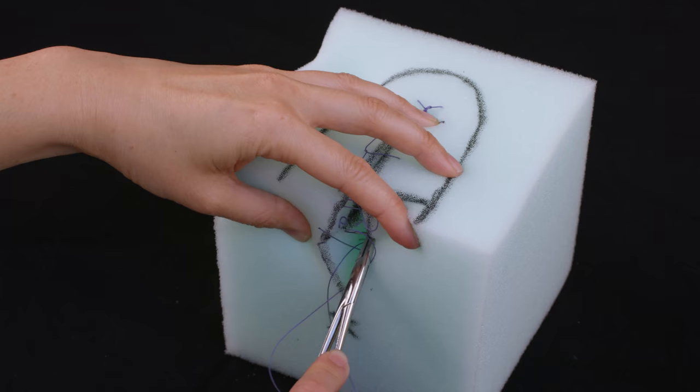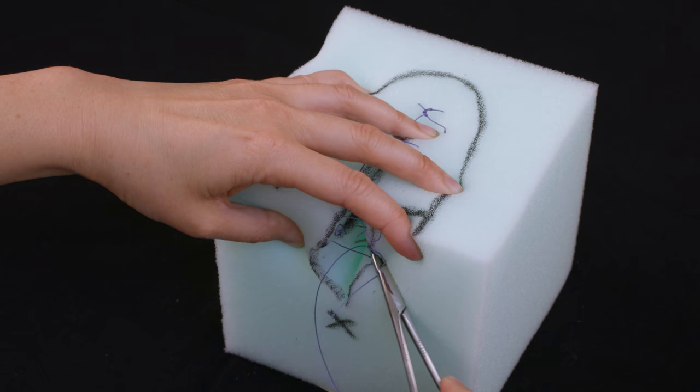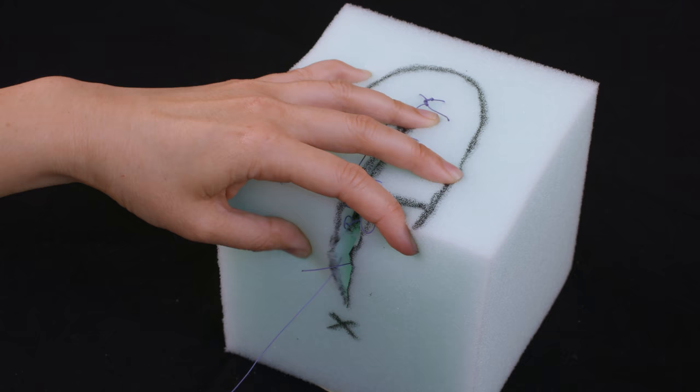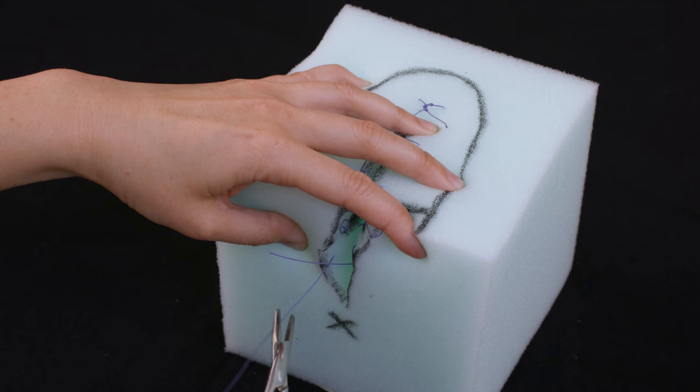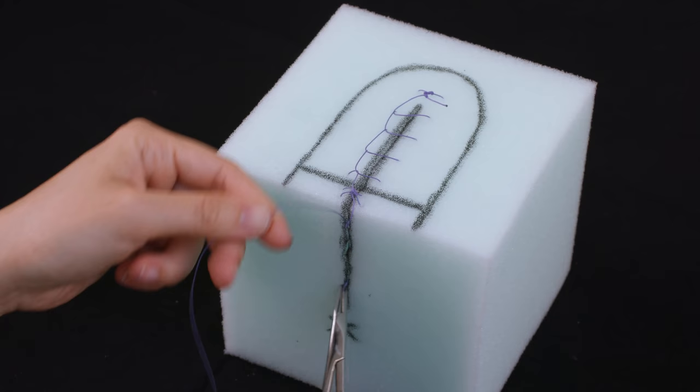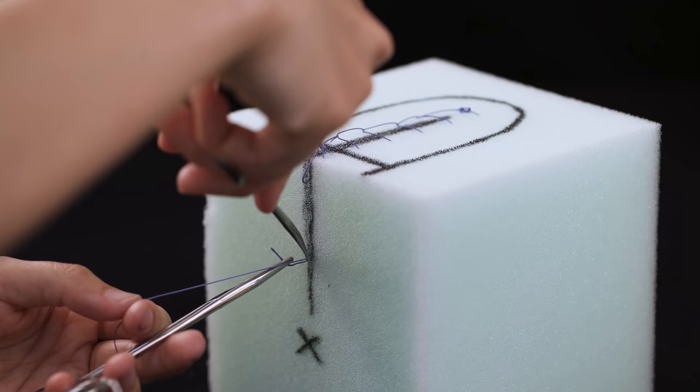You'll want to position the foam block or the patient on the edge of the table so that your wrist doesn't hit the patient's bed. For this demonstration, I'll tilt the block. Place additional interrupted sutures below the crown stitch to re-approximate the transverse perineal muscles and close the dead space. The entire stitch lies under the skin with a knot towards the outside.